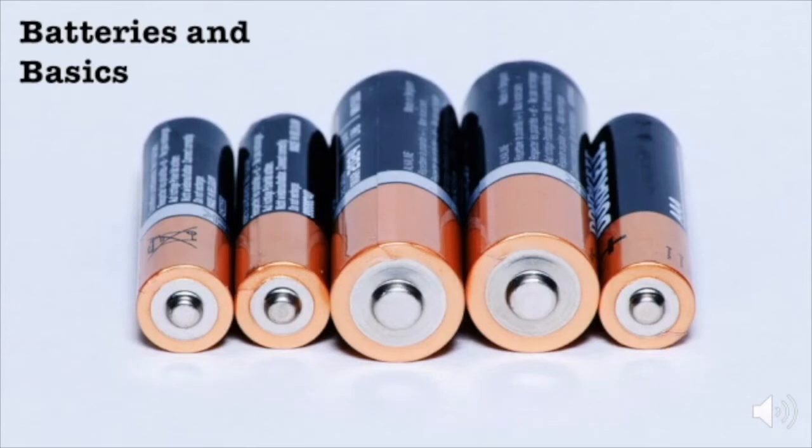One more note on batteries. Just like when you're using your iPhone in the airport, these things will lose their charge at the worst time. The patient will have a set of batteries and a charger at home. Regardless of any of the other interventions you do, you always need to remember to take the batteries and the charger with you.